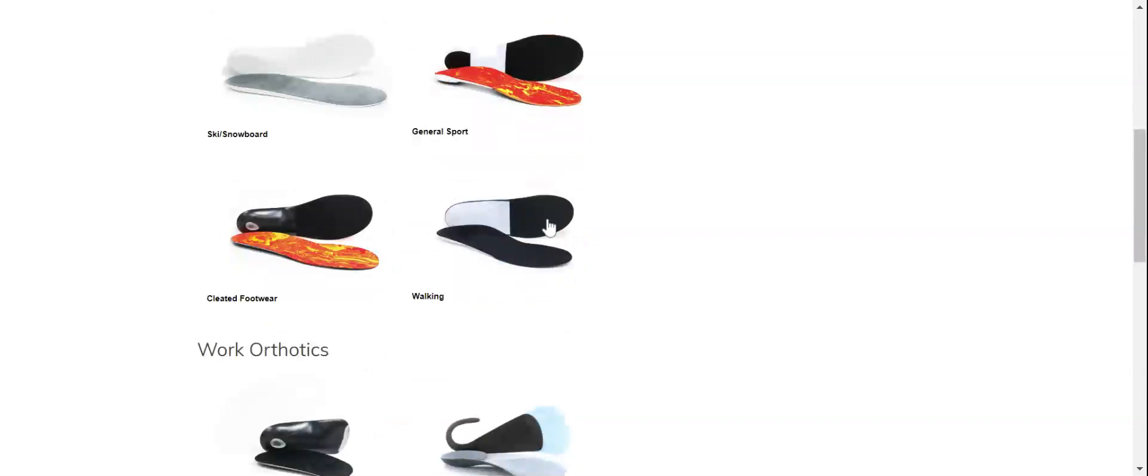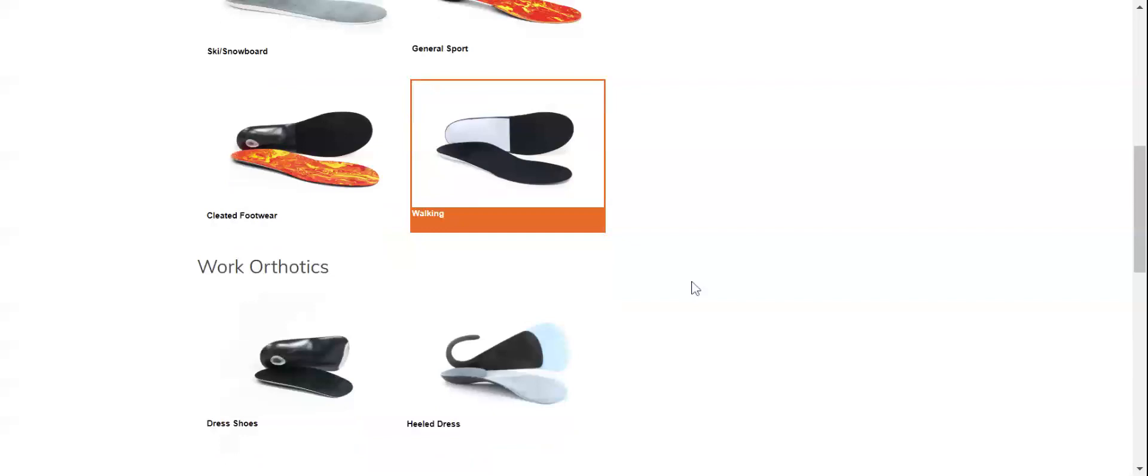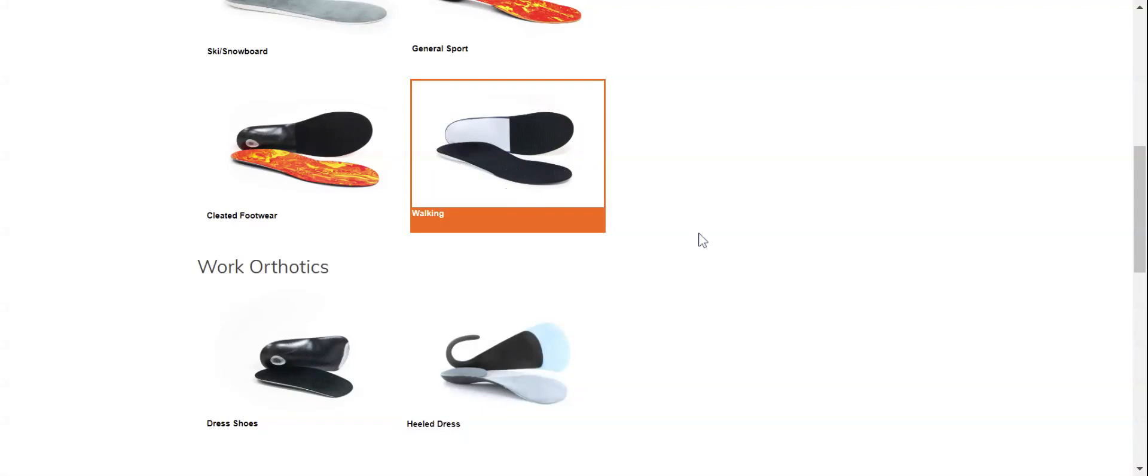For right now we'll pick one that hasn't changed in a while, the walking design, which is our most popular design. It's a basic polypropylene direct three-quarter length shell with no extrinsic EVA stabilizers, a full-length neoprene top cover, and a Durazole bottom cover.